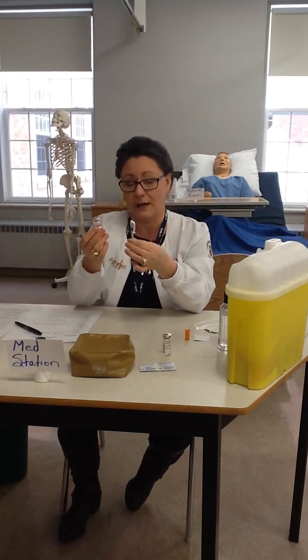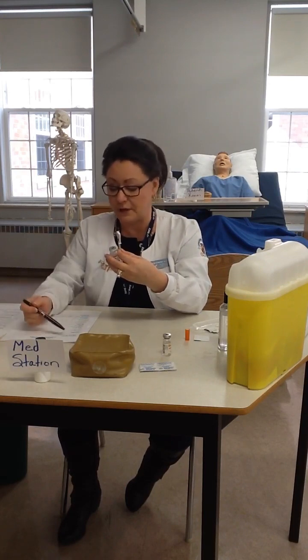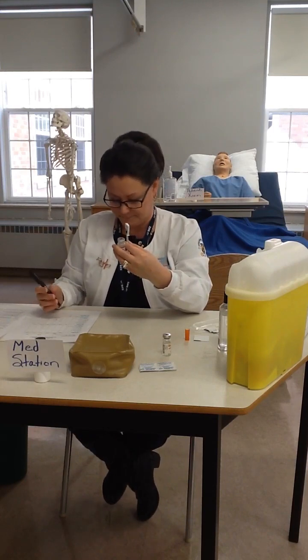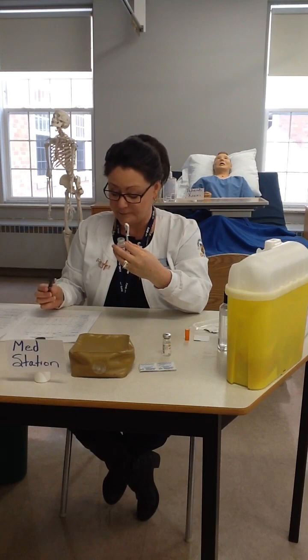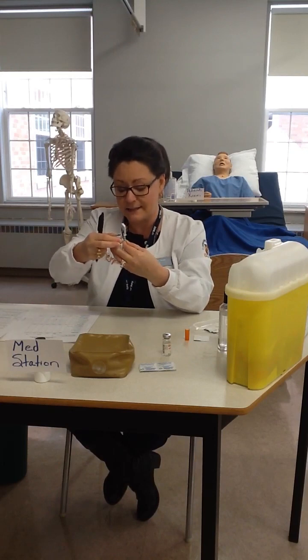Now that I have drawn up my second medication, I'm going to do my third and final check with the second drug. So I have the right patient. I know that Jesse is taking this medication for the right reason. It's because he is diabetic. I've done the proper assessment and education. I've taken a blood glucose level and checked and made sure he was above 5. Safe to give. I know breakfast is coming. And I have given him the right education and the right to refuse. He's good to have this. He's okay with that. He's given his consent.